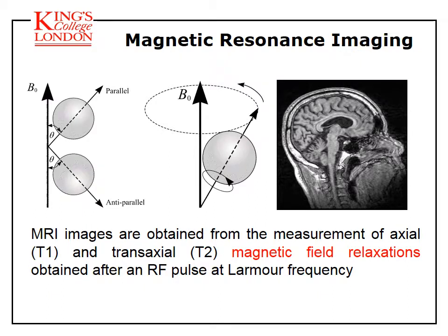Let's look at MRI. MRI is a technique that comes to mind easily. It measures the relaxation of water proton magnetization. It produces images of excellent resolution and quality, and is not radioactive at all. I hope you recognize that profile because that nose is mine. Paramagnetic labels such as gadolinium are commercially available.